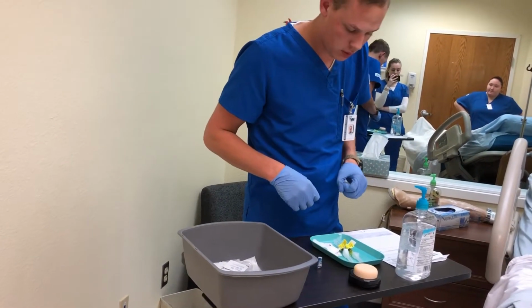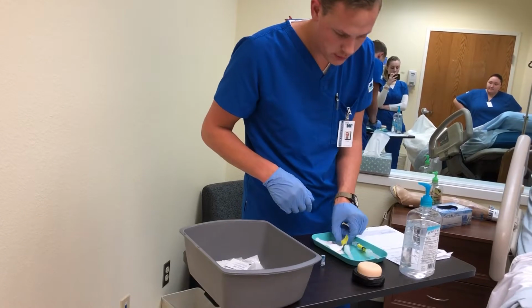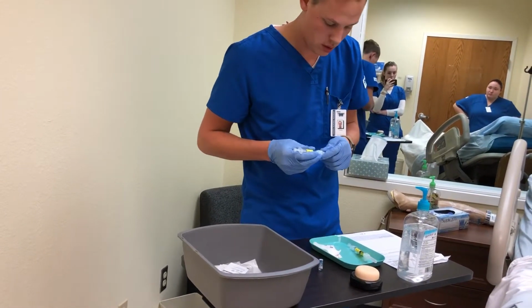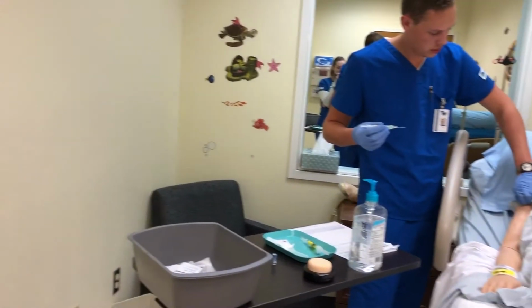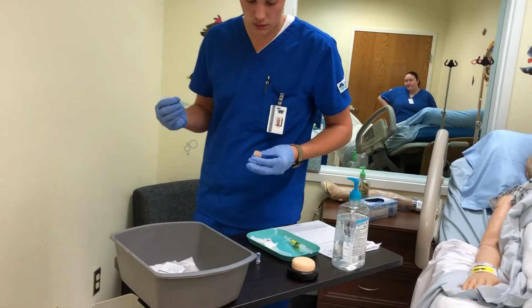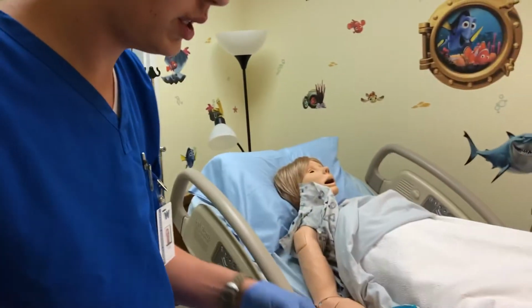And then next we're going to do the Phenergan, which is in the arm. So we're just going to uncap that one. Got an old Band-Aid on here. And I'm just going to have my Band-Aid ready here as well.